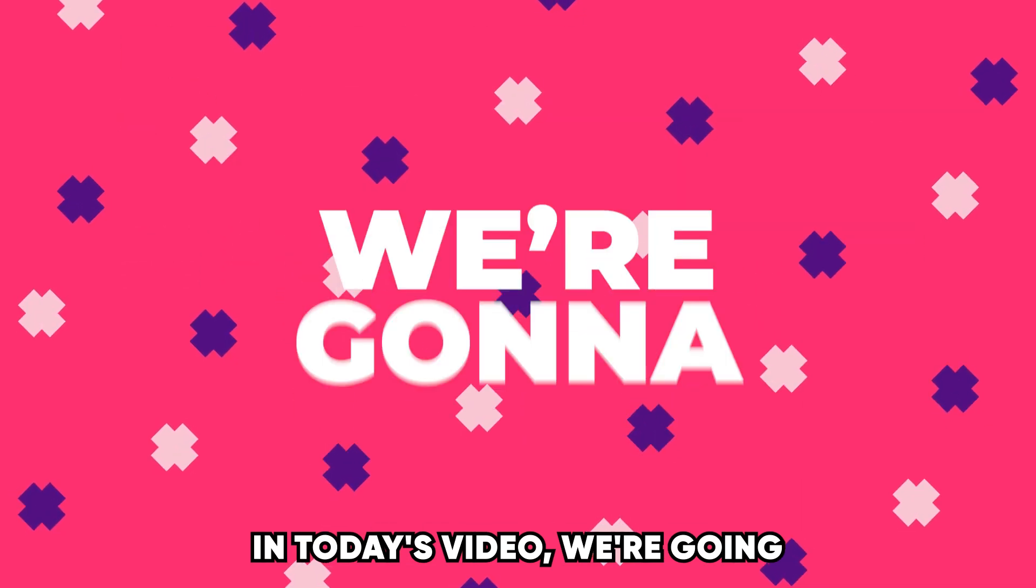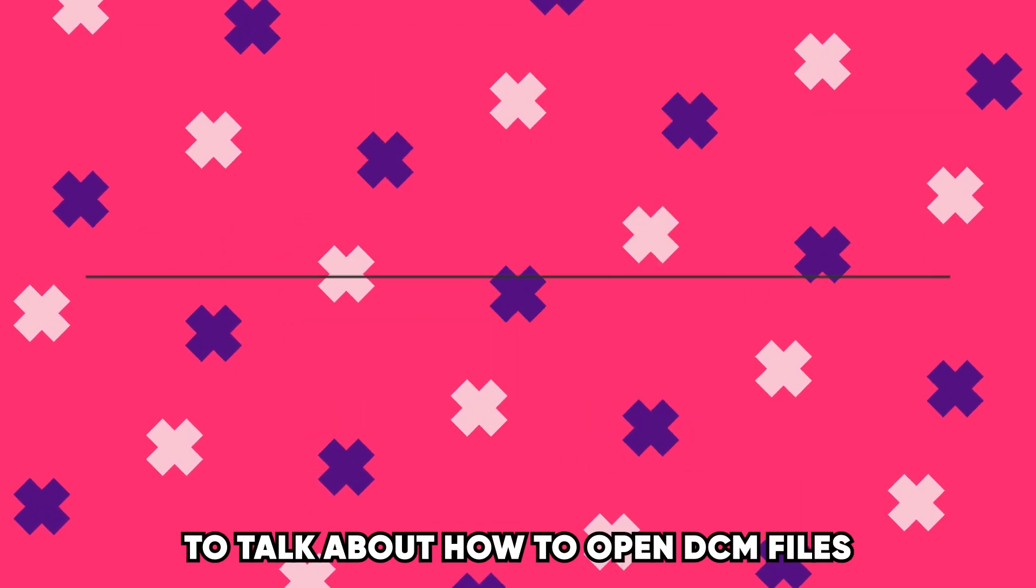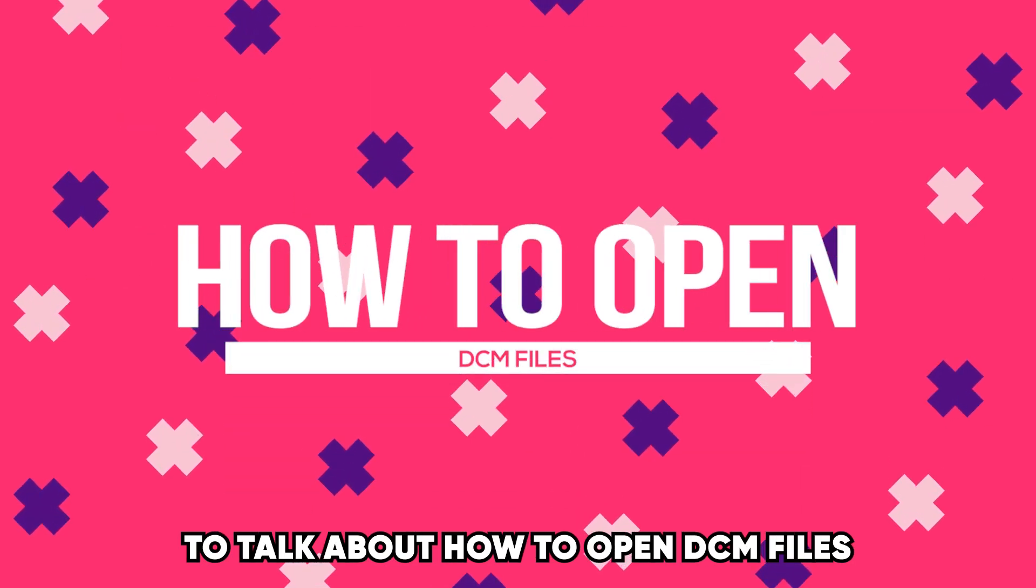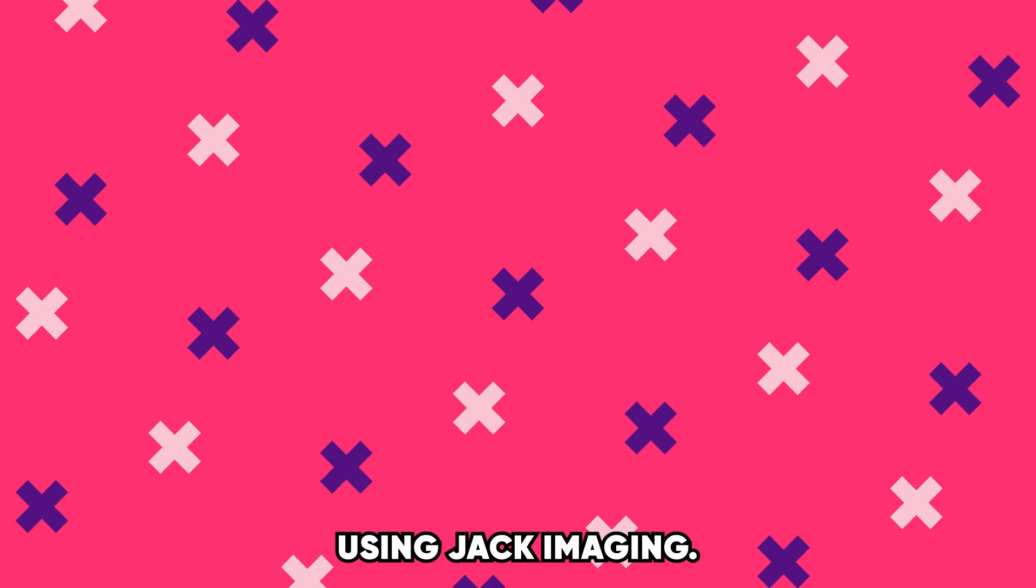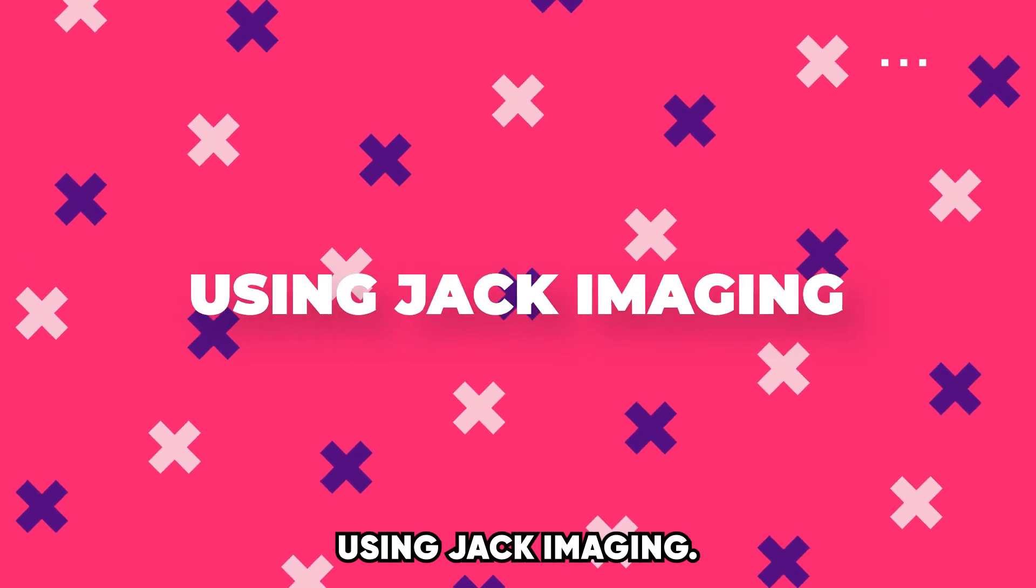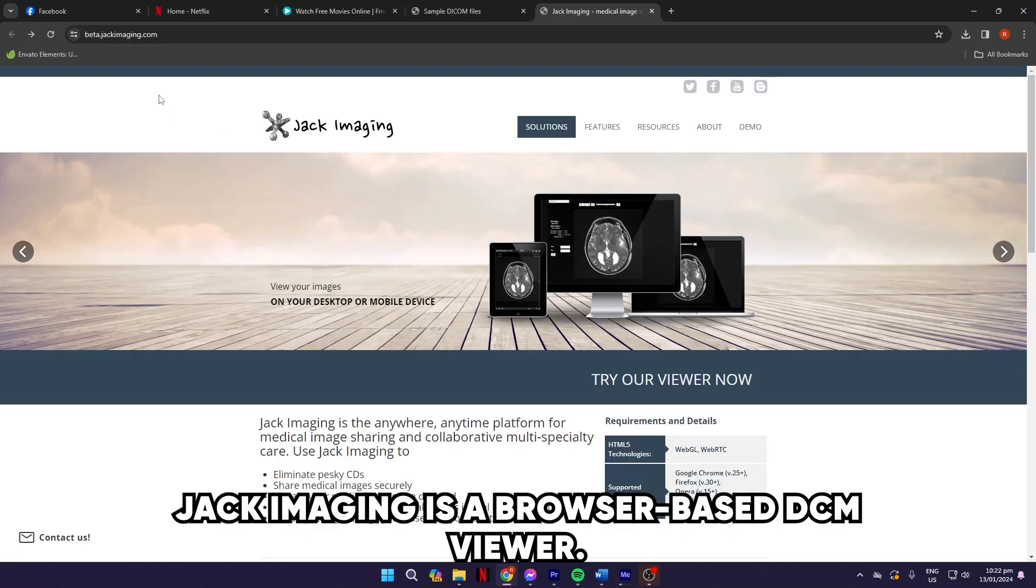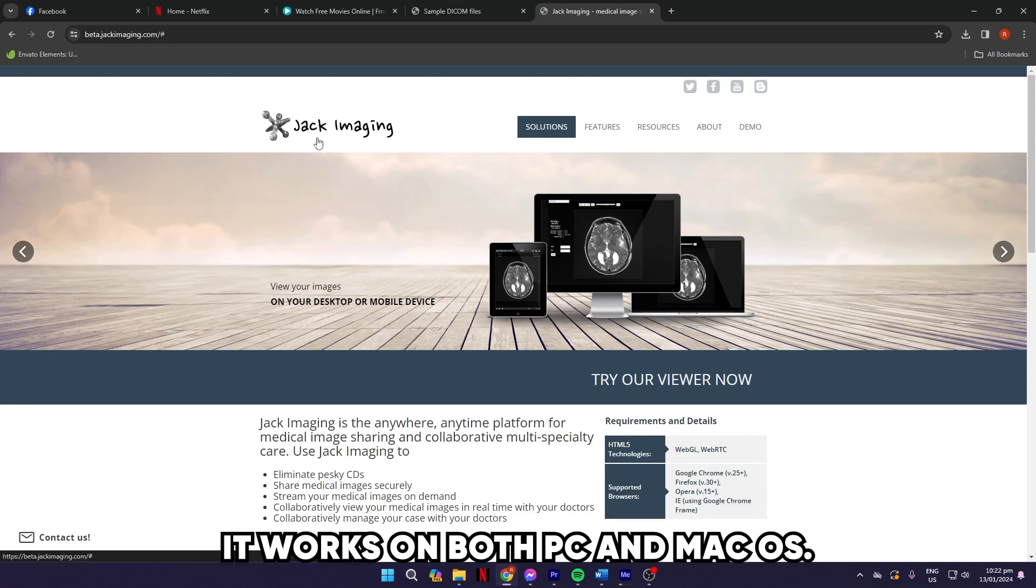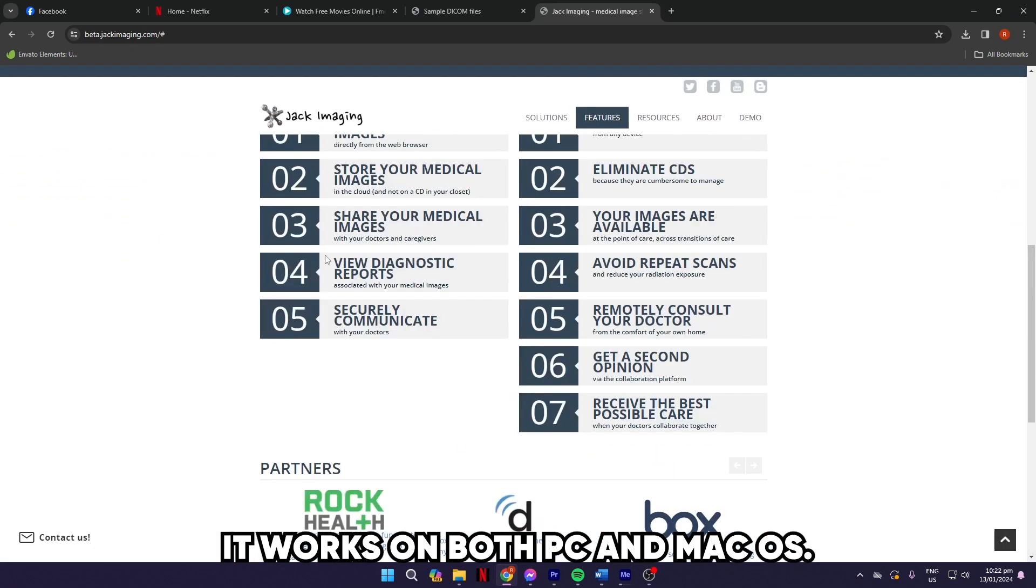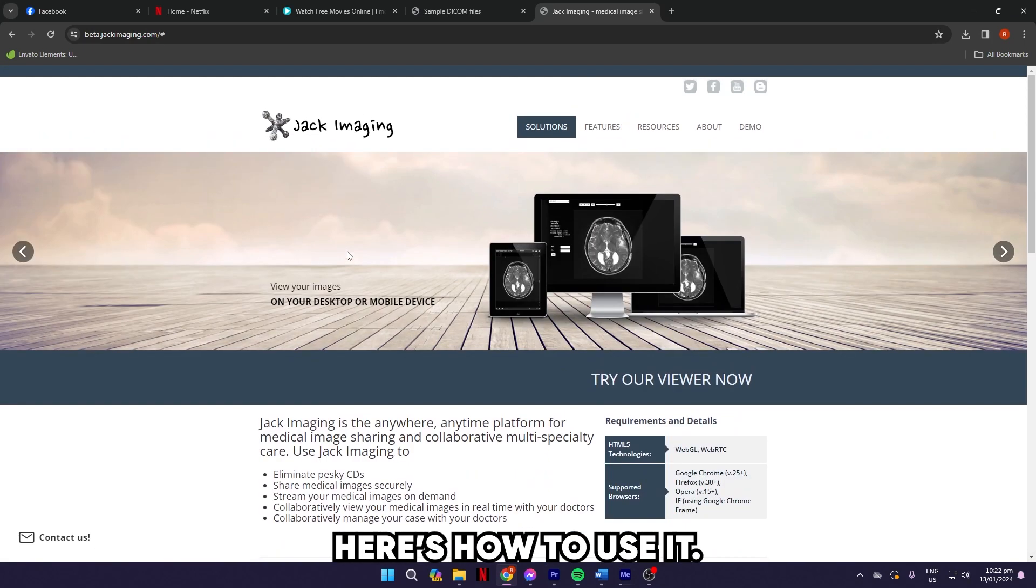In today's video, we're going to talk about how to open DCM files using Jack Imaging. Jack Imaging is a browser-based DCM viewer. It works on both PC and Mac OS. Here's how to use it.